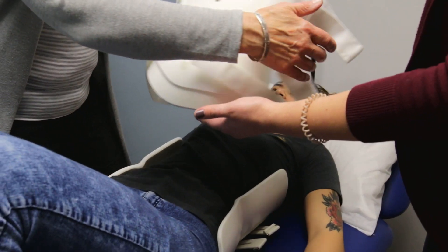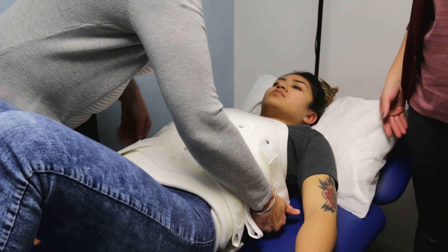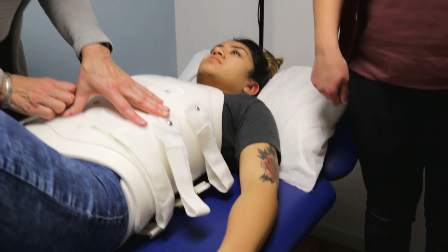The front goes over top of the back. This is a really important part and a common mistake that people make — we want to make sure that the front is going over top of the back section.